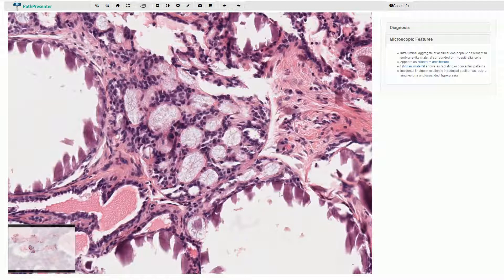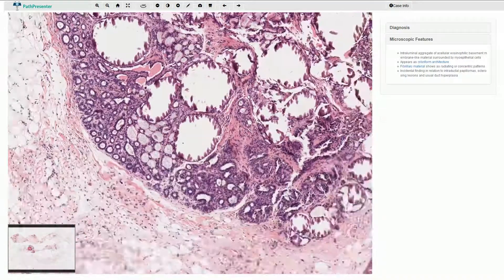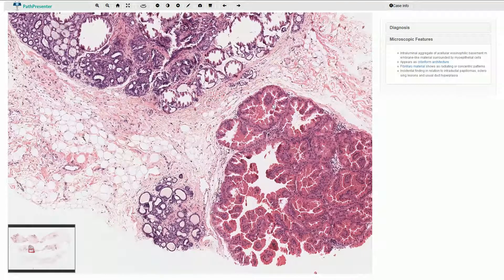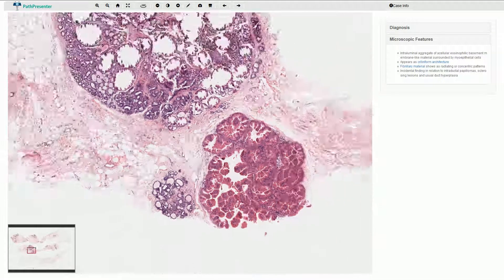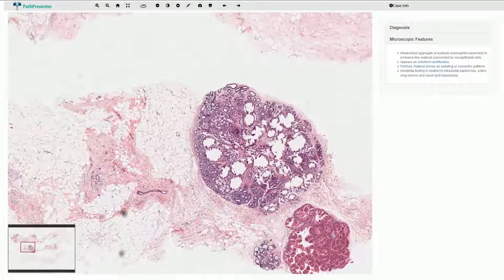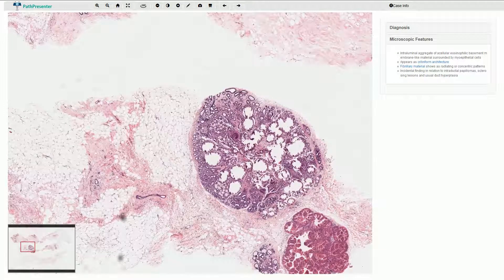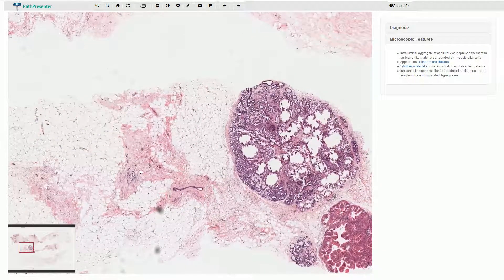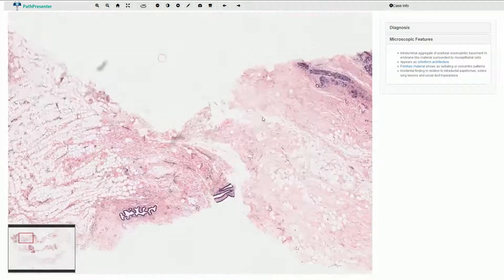Here we can also see these multiple calcifications. Here we have the focus of apocrine metaplasia. Here we have the slightly cystically dilated ducts. Otherwise we can see quite normal adipose tissue, some fibrous tissue and the more or less normal terminal duct lobular units.